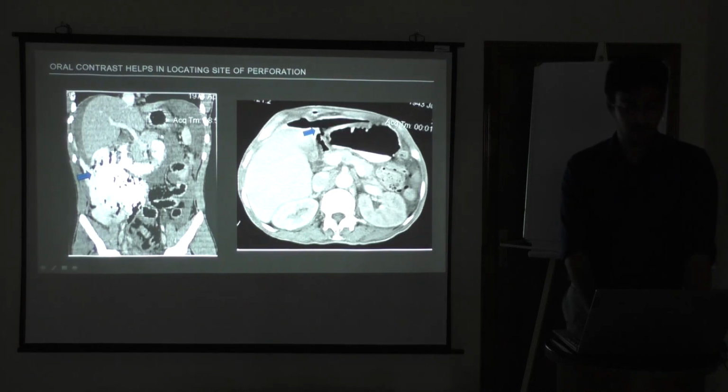So the point is, if you're thinking again the question, is it an abdominal bowel cause? If you're thinking in terms of perforation, adhesion or strangulation, then you give the oral contrast, because it takes much longer because the emptying time is quite long.